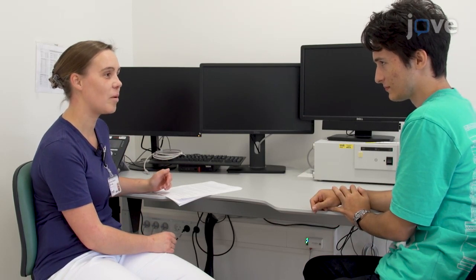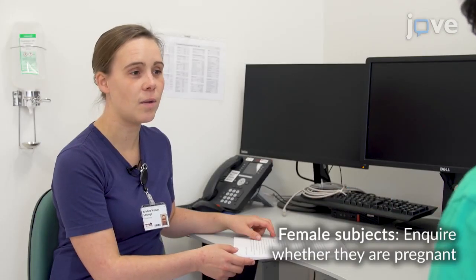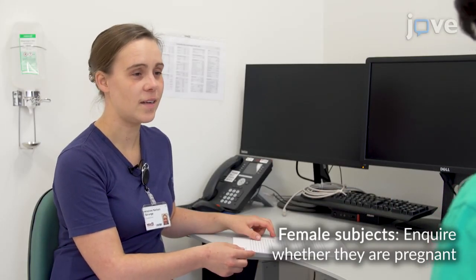Begin by assessing the subject's medical history and inquiring whether the subject has epilepsy, a pacemaker, or any kind of metallic implant in the body. Explain to the subject the details about the application of magnetic stimulation to the scalp, such as the stimulation will be heard as a click sound with a simultaneous muscle twitch. Each examination takes approximately 10 minutes.